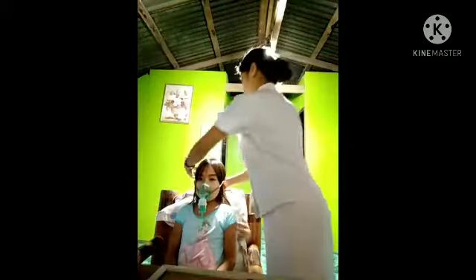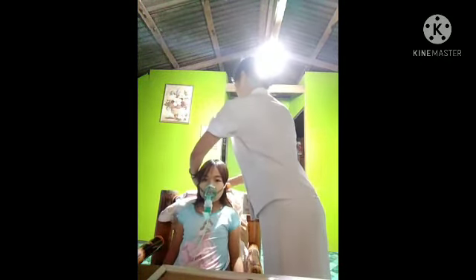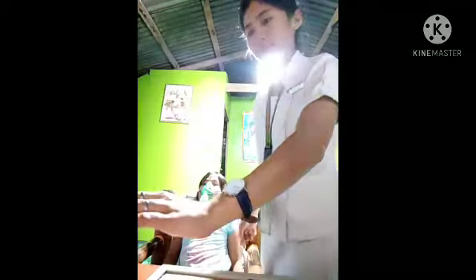Turn on the air compressor. This is to ensure the efficient vaporization of the medication. Observe the fine spray from the nebulizer. This is to check that the equipment is working.